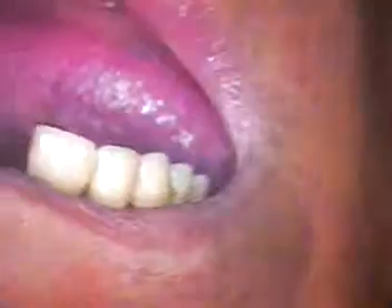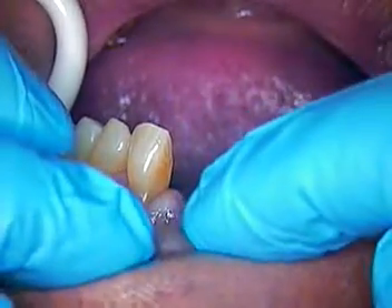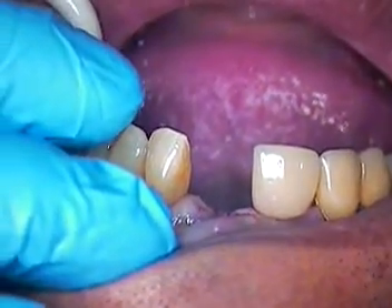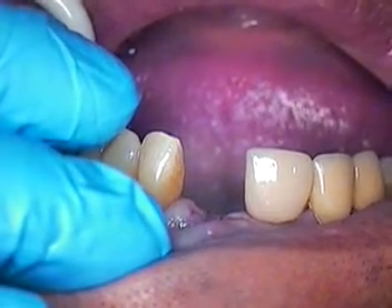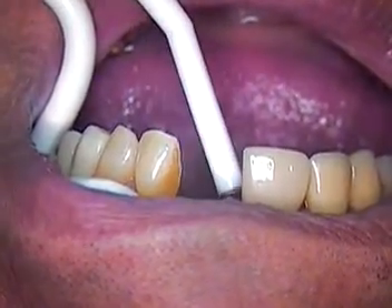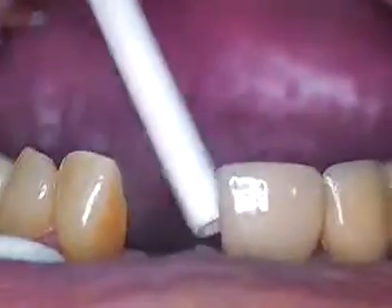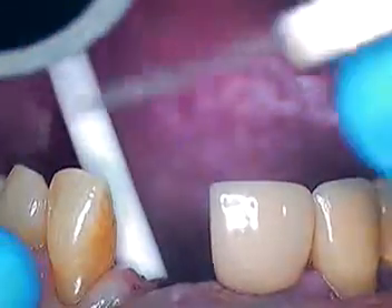Now step two is to go in the mouth and uncover the fractured portion. We did verify that the portion was movable or mobile in the fixture itself, but we don't know the condition of the internal aspect of the fixture, so we're going to find that out right now. I'm going to go ahead and just uncover the soft tissue — the patient is already anesthetized — so we're just going to go ahead with things now.